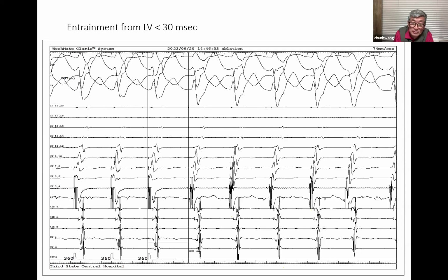That's a $1 million question. That's one of the reasons that you put a diagnostic catheter in the LV, a close-spaced decapolar catheter, and make sure you have reliable inducibility, and then you try not to manipulate that catheter. If you do a transaortic approach with a larger catheter, you're going to bump it at a much higher incidence than transeptally. That's one of the reasons we prefer transeptal mapping and ablation, with the initial diagnostic catheter transaortic, and we station it there as much as possible, minimizing the motion or movement of the catheter.